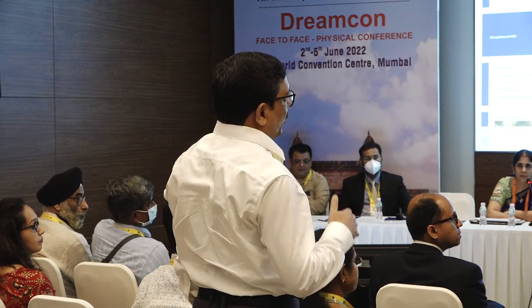Whatever the cut rate, the highest cut rate your machine has, either 2,000, now I think even 5,000. There are machines which have very high cut rates, because when you cut fast, you get small segments of vitreous. If you have longer segments, there is more likelihood that you'll be pulling on the segments. More likelihood of traction. Traction will lead on to vitreous base traction, leading to GRT, CME, and all those other complications.